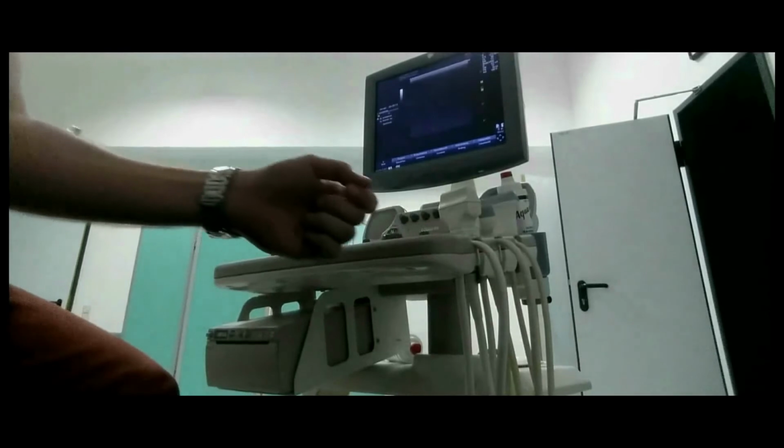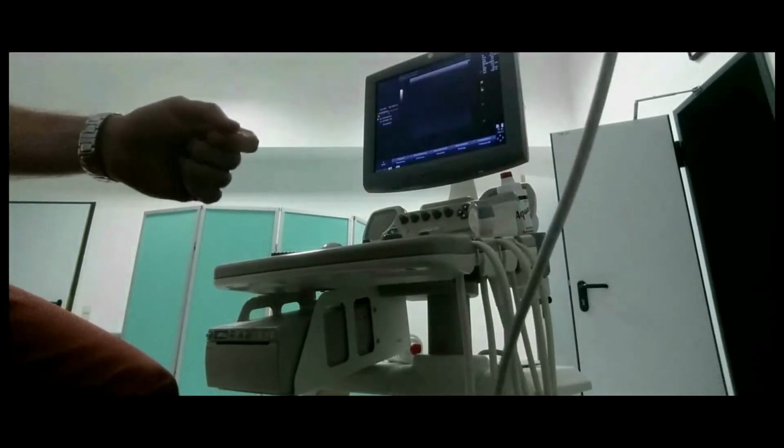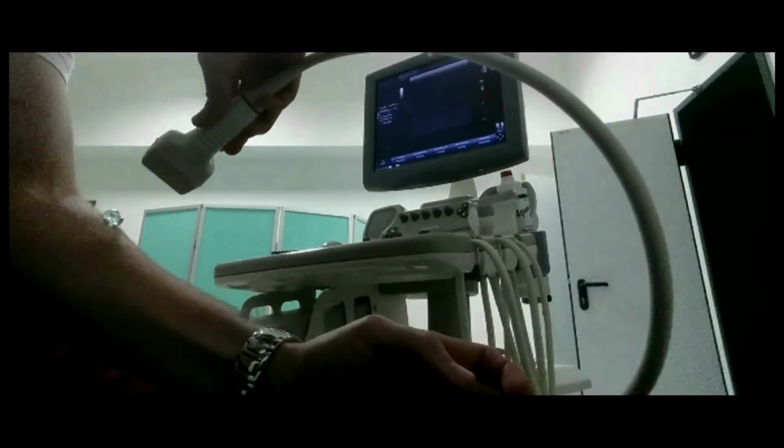So finally, let's try out the device, and since we are not a physician, let's hope we can recognize something. For what reason do we actually need that gel between transducer and skin surface? Well, our bodies consist of about 80% water. That means our fat, muscles and brain contain a lot of water.